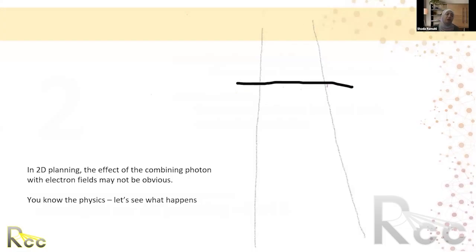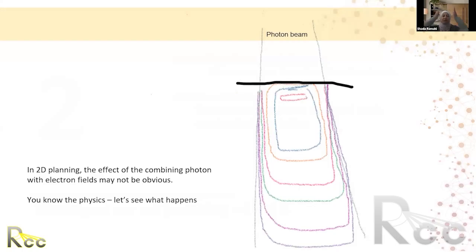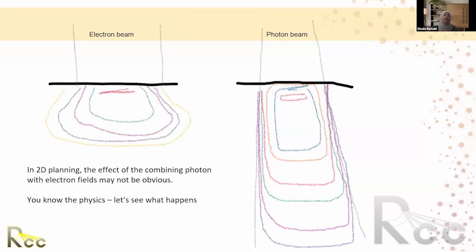All right, so we do know how the isodose lines of a single photon beam look like, right? They're nice straight isodose lines with 50% following the beam edge, and then very tight penumbra, right? And we also know how an electron beam isodose looks like. The lower isodose lines are spread sideways on both sides. And then the 100% and the higher isodoses are kind of tighter.